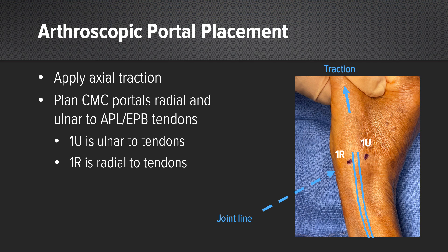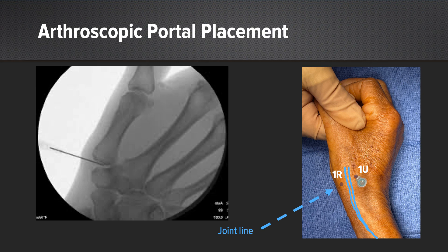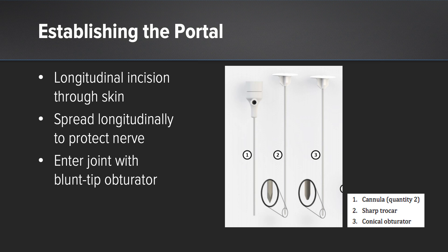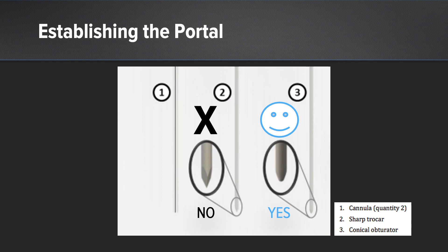Gentle traction is placed on the thumb CMC joint. The CMC joint can also be confirmed using a 25-gauge needle, placing gentle traction on the CMC joint and using fluoroscopy to confirm the placement of the 25-gauge needle. Once the position of the portal has been established, a longitudinal incision is made through the skin. Spreading is performed longitudinally in order to protect the radiosensory nerve. The portal can be entered using a blunt trochar. Using a sharp trochar can injure both the tendon and/or the nerve.